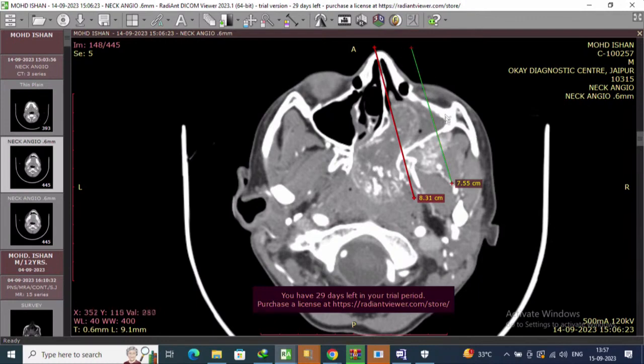So this modified Denker's will give us a head-on access. The only thing which is limiting our access, which we have to manage intraoperatively, which is complicating the life, is this. In this access, this is coming in between. This anterior extension of the tumor, which we will reduce somehow, so that we can maintain our visualization.